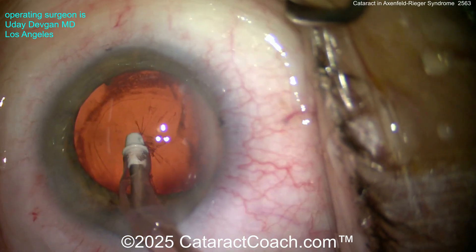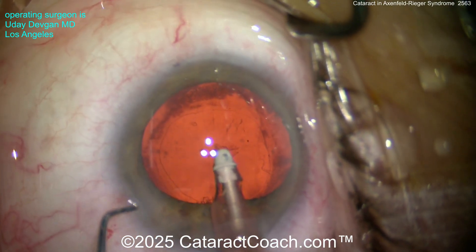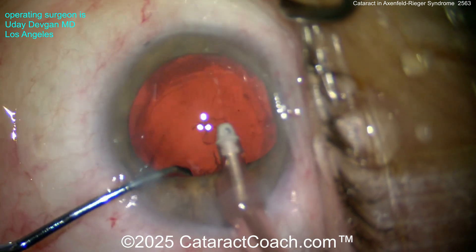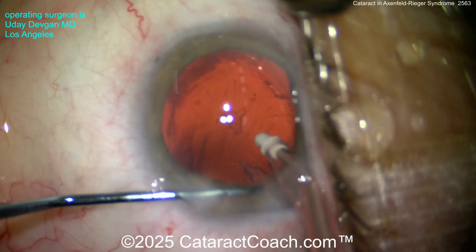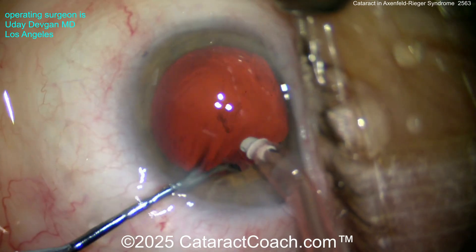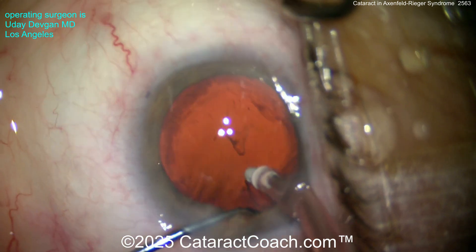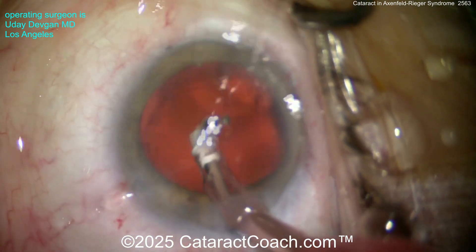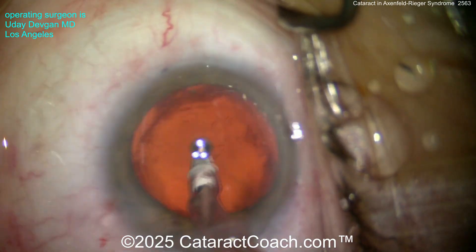Slowly cleaning up the cortex, being very cautious — a little bit adherent to the posterior capsule; we definitely want to get that. Now checking with the chopper — lifting the iris up, you can see sub-incisionally where it doesn't dilate there was a big piece of cortex. Aspirate that out — that's important to check.